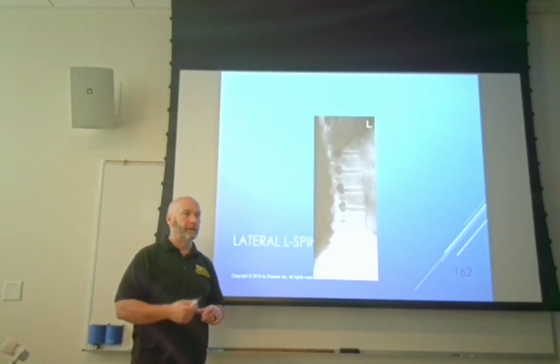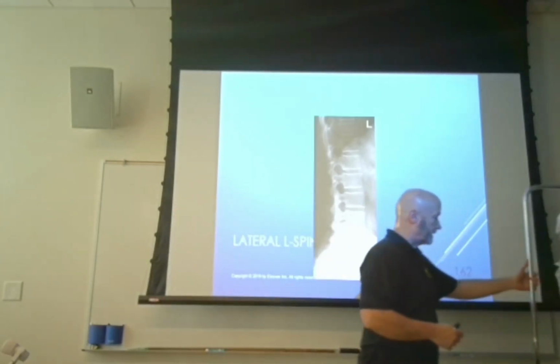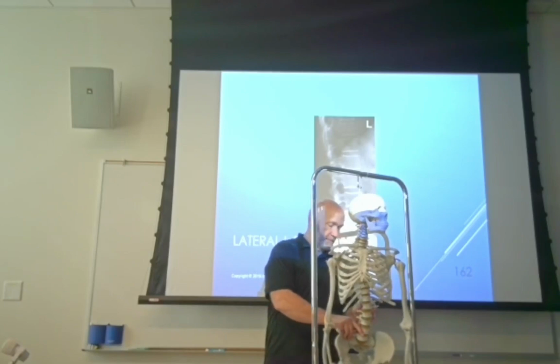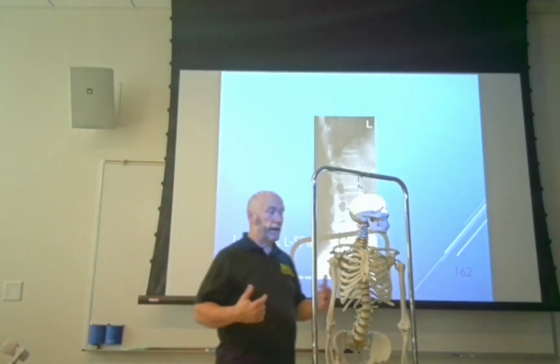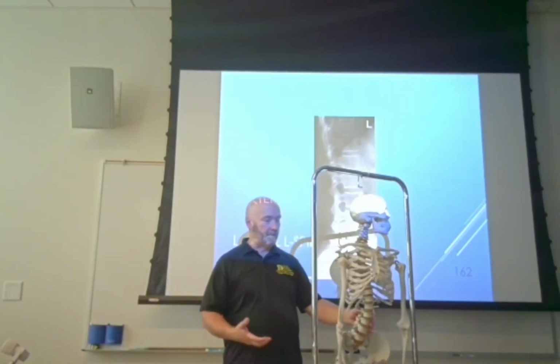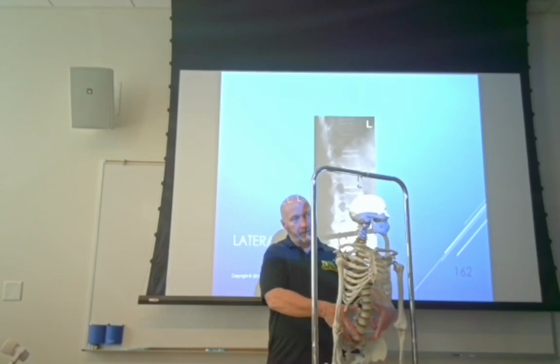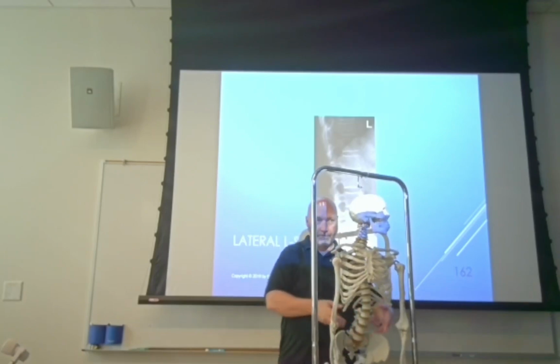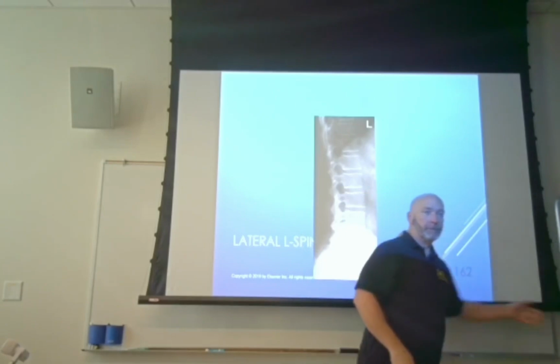And I don't know if I've related this little story, but I had a patient one time. It wasn't mine. I was a clinical instructor at what is now UT. I had a student that was getting ready to do an IVP on the patient, and we shot the scout on the patient, and there was this weird football shaped density that looked like soft tissue with just the tiniest amount of calcium in it. It looked like the size of a football sticking out on either side of the vertebra. There's only one thing that could have been, and that was a massive AAA.